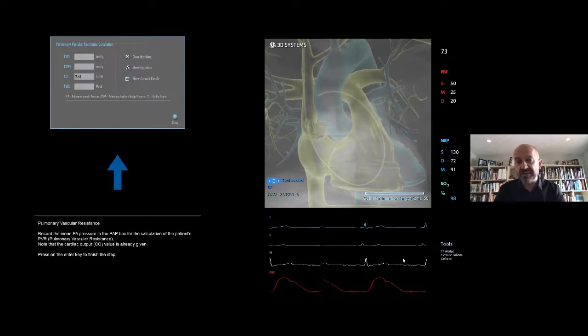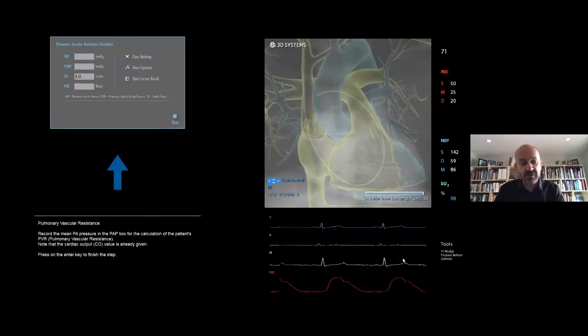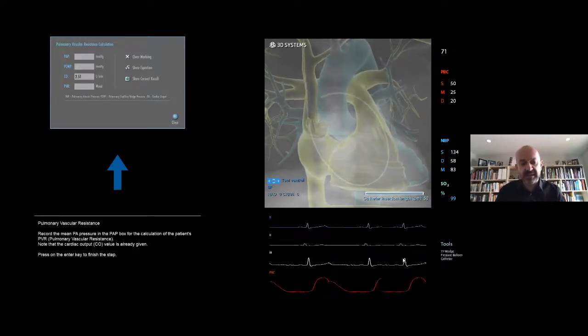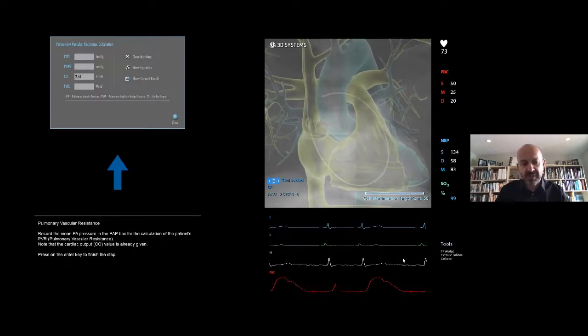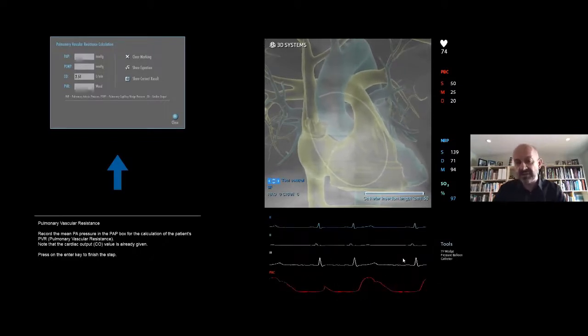Again, this is very simplified, but this is the classic use of the catheter to help you distinguish these two conditions. What we've seen with COVID is you can really see almost anything cardiac-wise, and it's a great mimicker of many cardiac conditions. So that's why this use of PA catheters may be a bit higher in this situation.